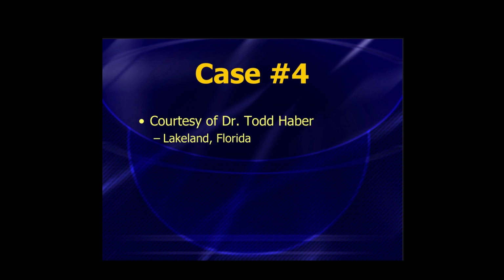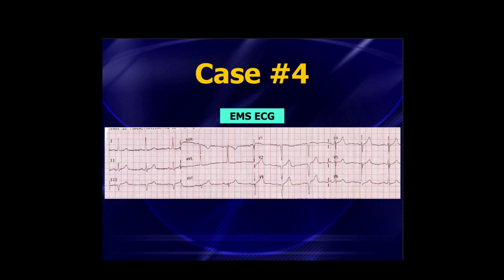How about one more case? This is from a good friend, Dr. Todd Haber in Lakeland, Florida. Todd has sent us a large number of cases that we've been able to take advantage of and learn from. Todd was taking care of a 66-year-old man with 1 hour of chest pain. He gets a quick 12-lead ECG. Actually, I take that back. This was the EMS ECG, number 1, I will mention. This is the first one that the paramedics got.